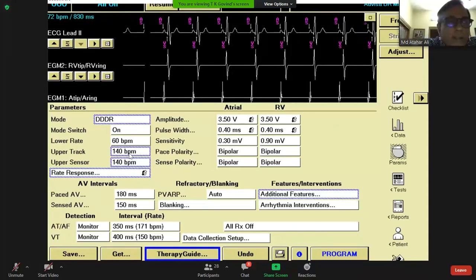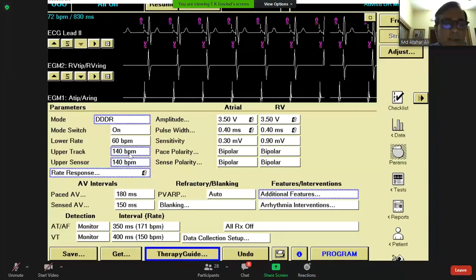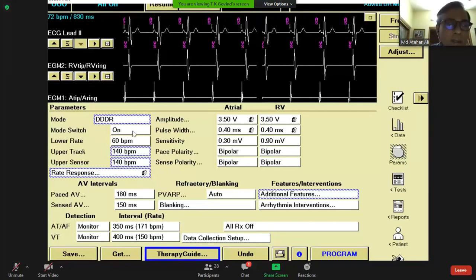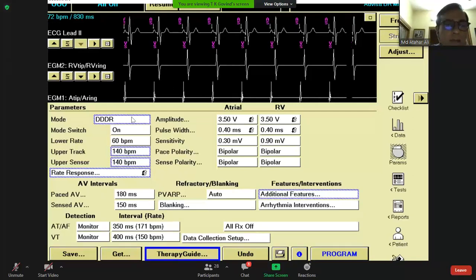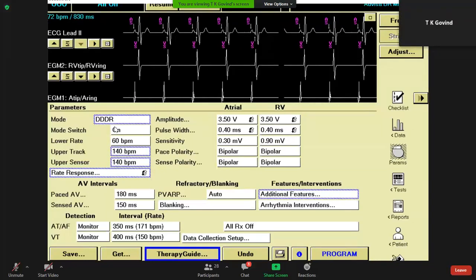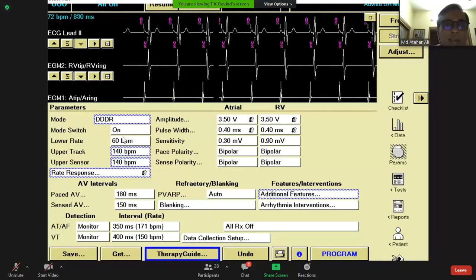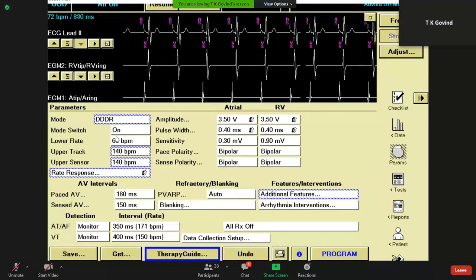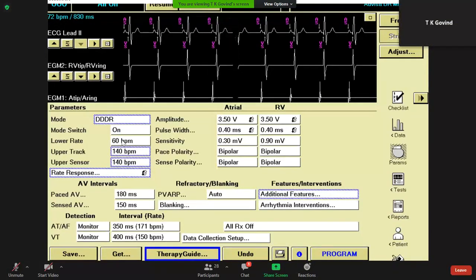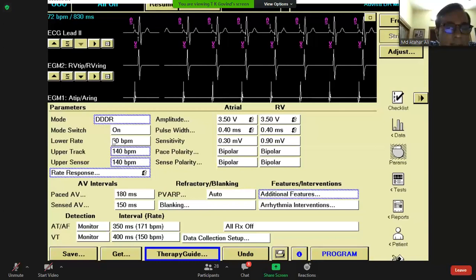Yes, thank you. Govind, there is another problem in case of sinus node dysfunction. The chronotropic competence is okay, but the patient does have paroxysmal atrial fibrillation, not too frequently, but sometimes once or twice in a month. And the patient feels symptoms when there is a transition, when the pacemaker mode switch is on. During the transition from DDD mode to VVI mode, the patient feels the symptoms. Is there any role of DDI programming in such a situation?